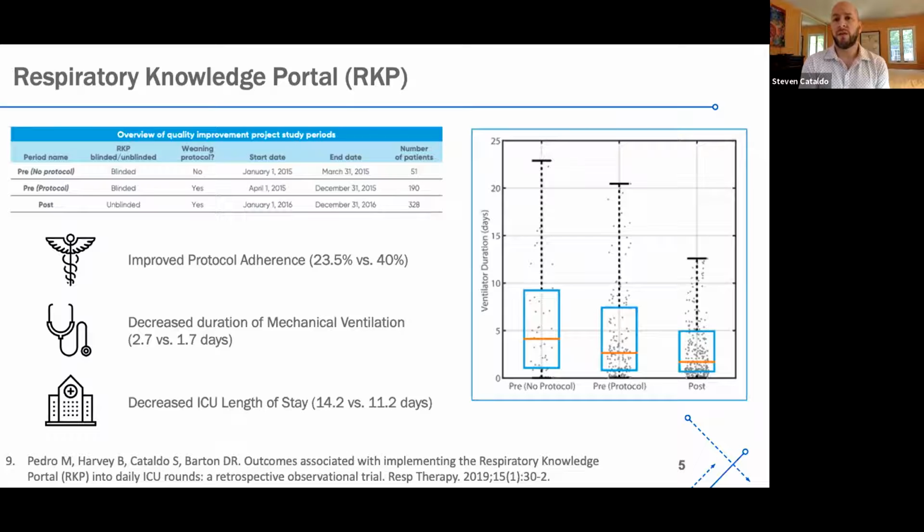Now, we know that the mechanically ventilated patient is ever changing, right? Their vent requirements are ever changing throughout the day, throughout the night, from day to day. We know that decisions are made within a multi-specialty rounding type service in the morning, right? Where multiple teams get together, we all talk all at the same time, and we really combine all of our knowledge, and then we can go ahead and enact therapy for that day.